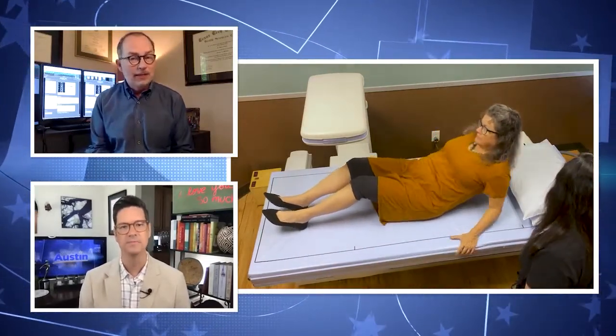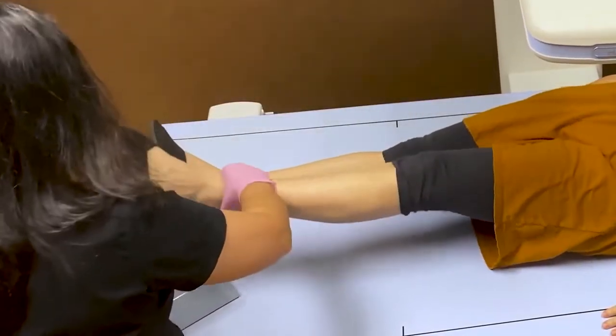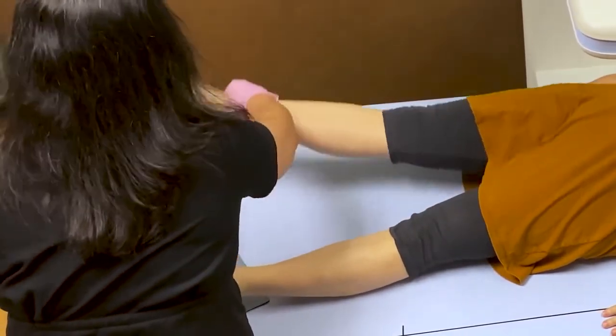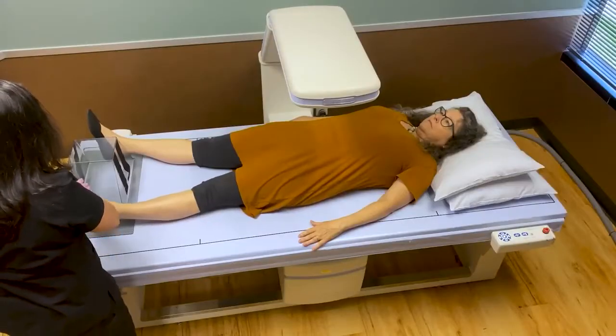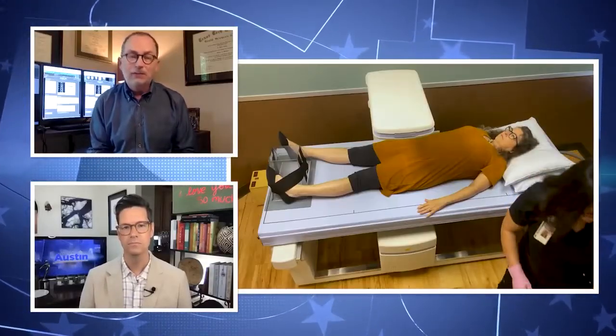That makes this exam even more important — the bone densitometry exam. We have some video so our viewers at home can see how this exam works. Here we have our patient getting ready for her exam. Basically, you lie upon a table which has an x-ray attached to it. They'll take two images: an image of the lumbar spine and then an image of one of your hips. If you have metal in your hip, they'll take an image of your forearm. Both images take less than a minute, and the whole exam takes less than five minutes.